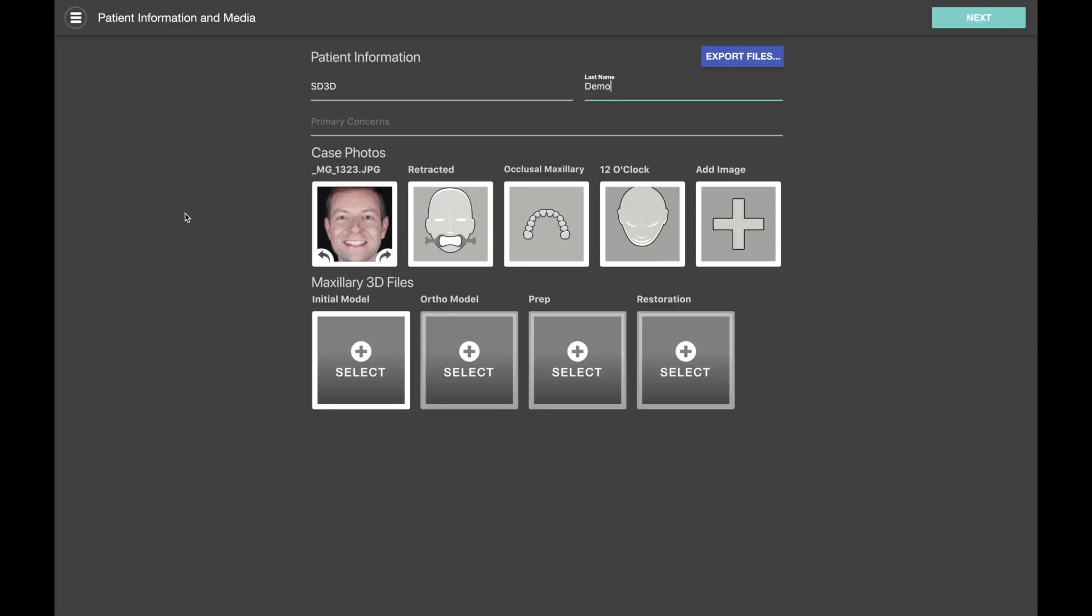So we're going to start at the patient information screen. As you can see, starting with version 3.1 in Smile Designer, you can bring in photos and also 3D model files.